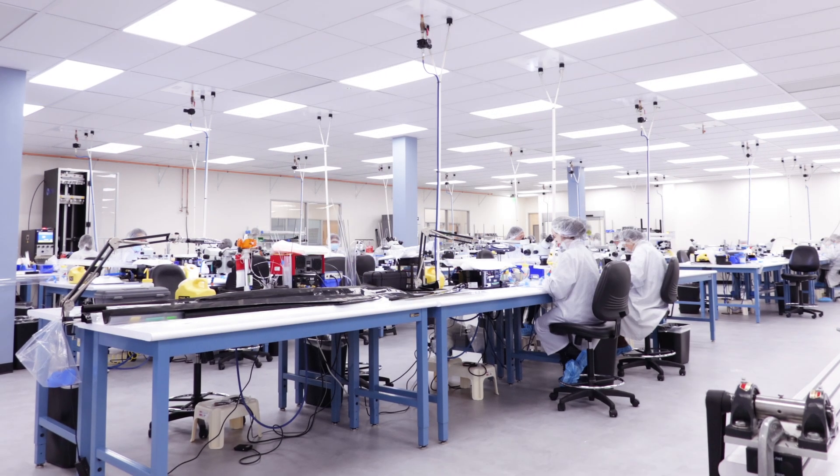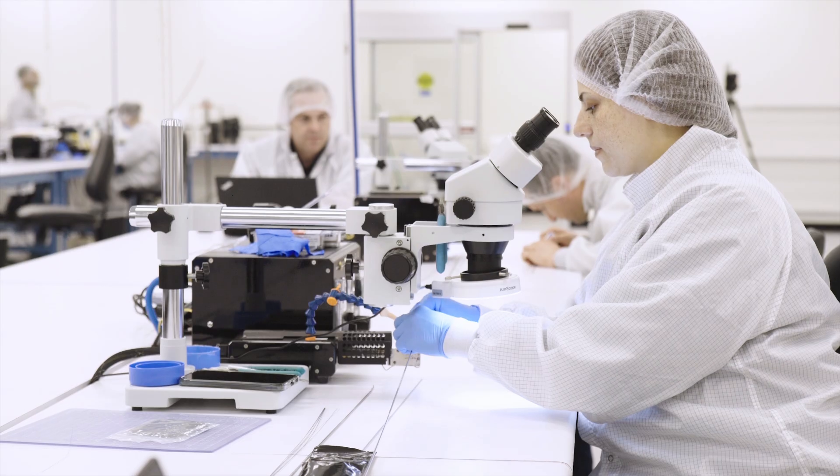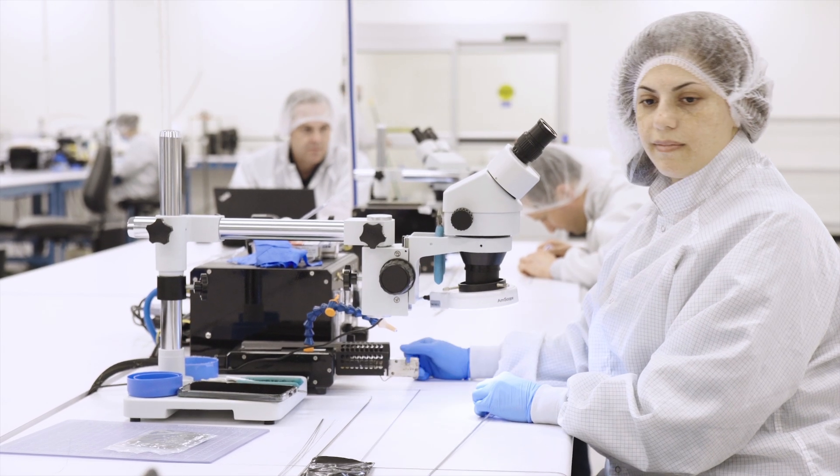Catheter designers are always striving to build more capable devices to deliver therapies as effectively as possible within the body. In recent years we've seen tremendous interest in steerable catheters, which provide more control over the distal tip with the help of pull wires.